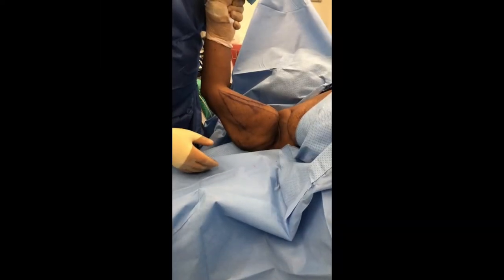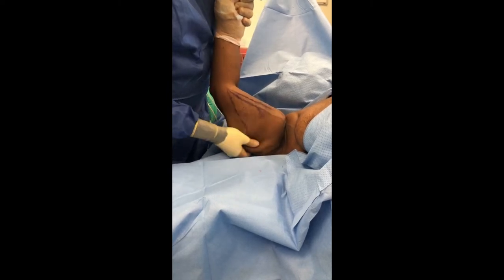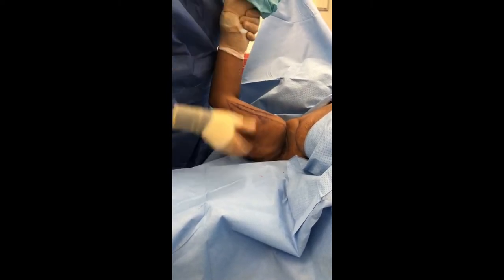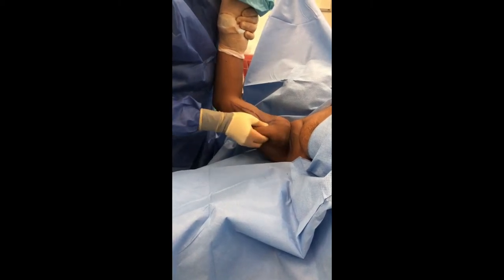Here we have a patient, and once again we always want to thank her for allowing us to do some filming today. She has a lot of excess skin on her arm — just at her elbow, her hand is up here — and you can see all of this loose-hanging skin is what we're going to remove today.